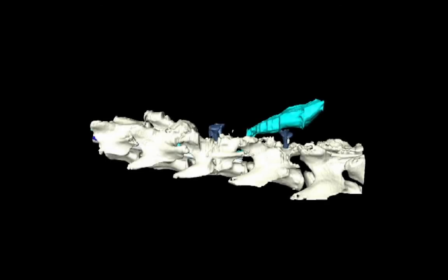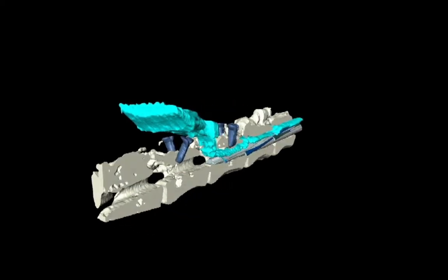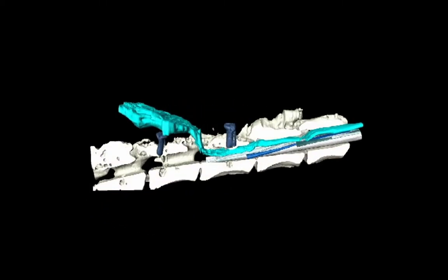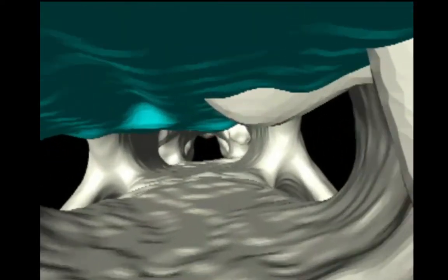We implanted the eDura into the subdural space of the spinal cord. The eDura is secured using a customized vertebral orthosis. This computed tomography reconstruction demonstrates the biointegration of the eDura within the spinal tissues after several weeks of implantation.